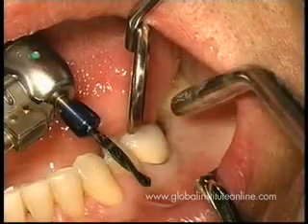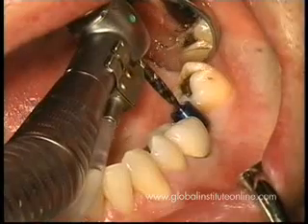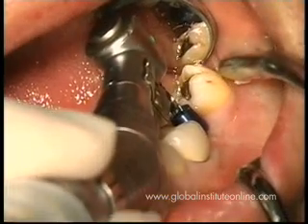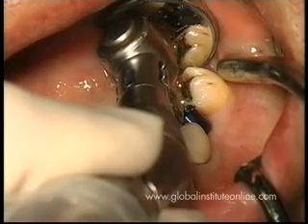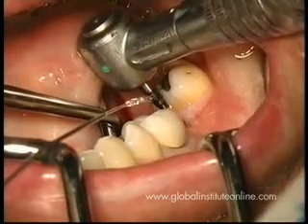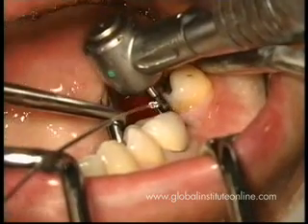The first drill will be using a 2 millimeter drill to perforate the soft tissue within the keratinized tissue in exactly the optimal position for the later implant placement. The depth we'll be looking for is 10 millimeters in this particular patient, and that's the perforation within the bone, as you can see here. 10 millimeters, utilizing the gingival cuff included in this 10 millimeter measurement.